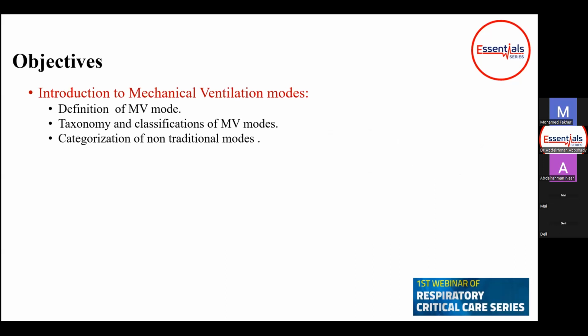Last, we will talk about the categorization of the non-traditional modes. We all use the conventional modes: volume control mode, pressure control mode, SIMV, and the spontaneous mode. These four modes have been established in our practice since the 1980s. Yet, since the 1990s till date, there have been many modes in the market. So we are going to categorize them in clusters that look like each other. That's the first objective of our session, an introduction to the mechanical ventilation modes.